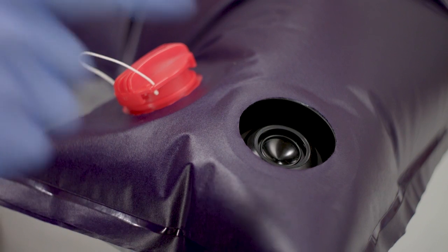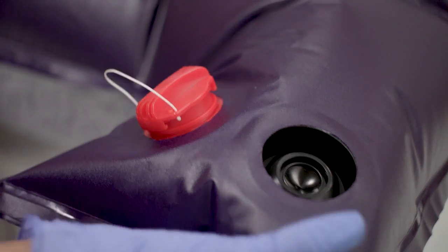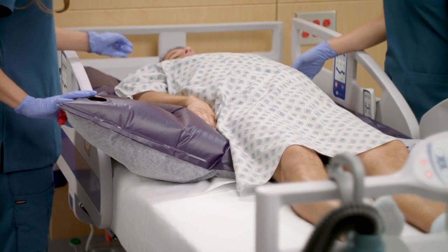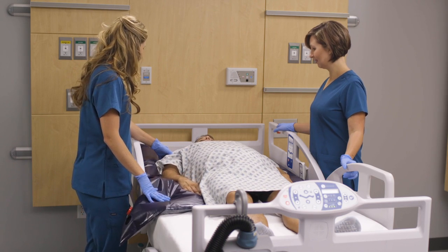To adjust the level of inflation slightly, depress the center of the inflate valve to release air. For rapid deflation, remove the red cap from the deflate valve — this will quickly deflate the positioning device. Make sure the patient is attended and stabilized during deflation.